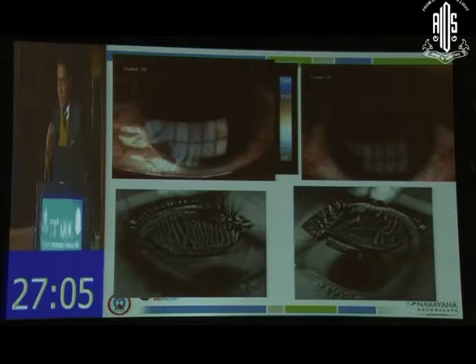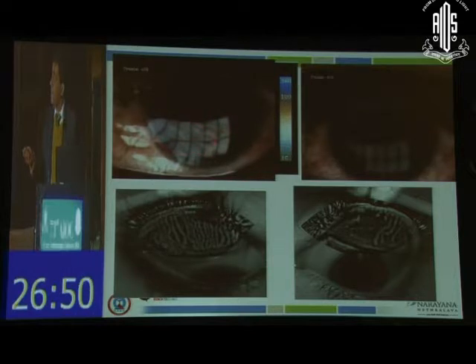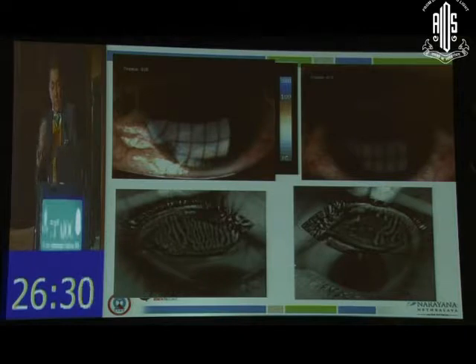I'm not really going into the basic evaluation of the tear film. What we're trying to see is that the future of evaluating is actually trying to quantify. Each time the patient blinks, you see colors out here. Each of these colors has a pattern, with a permutation and combination of 1 billion, and that is given to you by this pattern, and it gives you a value. That just tells you the quantity of lipids in your tear film. You don't need to do all this. It's a Schirmer's test, but still enough as a gold standard for your refractive patients. But this has already been covered by Dr. Geeta. So I just thought, what are the future directions of trying to understand the tears itself?